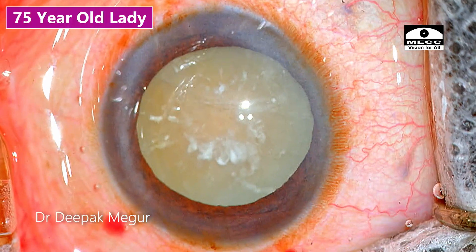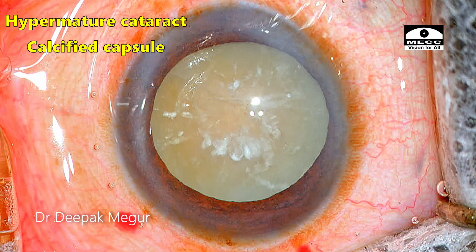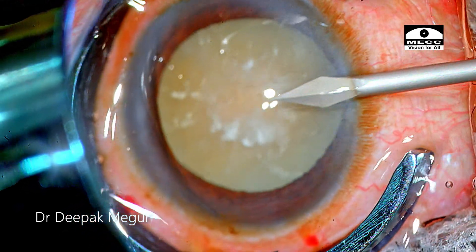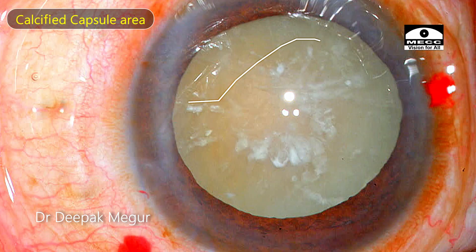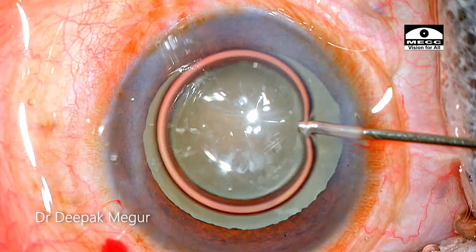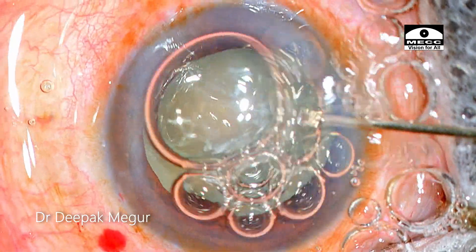This is an elderly 75-year-old lady who has a hypermature cataract with calcified capsule. We have multiple challenges to deal with. First, we need to deal with the rhexis because it's quite difficult to get the rhexis in these calcified capsules. Luckily, the calcification is just occupying the central portion and the peripheral extension is not much. Let's see what strategies I follow.